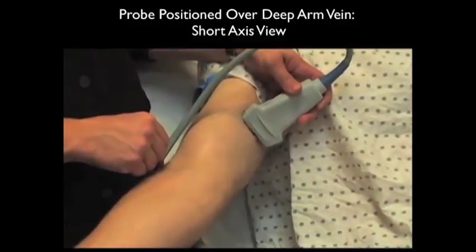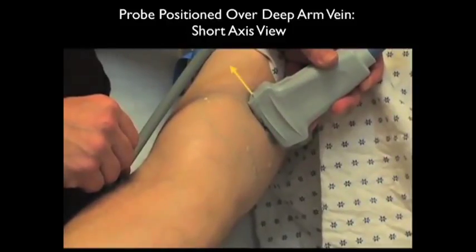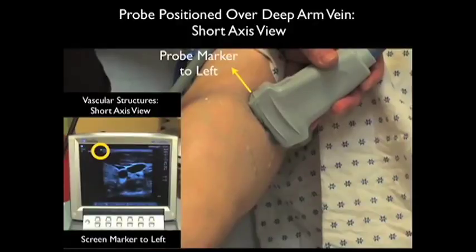Notice here that it's placed in a short axis or side-to-side configuration. Here we have the probe positioned over the more medial basilic vein. Notice also that the probe marker here is towards our left as we stand in front of the patient, and the reason for that is note on the screen that the indicator dot is also located here to the left. Therefore, left on the probe lines up with left on the screen.